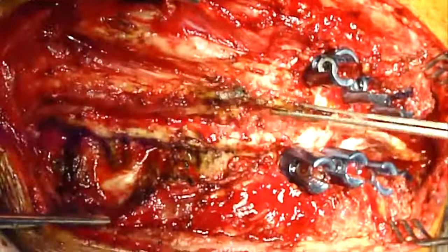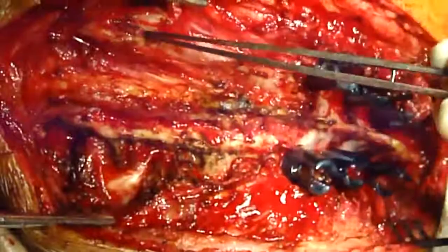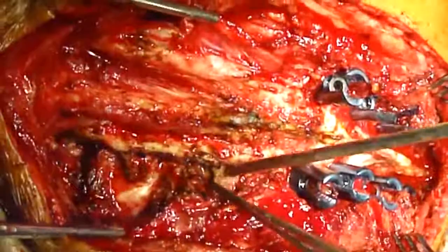The free-floating spinous process was just behind the apex of the thoracic kyphosis. What is being pointed here are the lateral boundaries of the dysraphism in the upper thoracic region — those are the transverse processes of T5, T4, and T3.